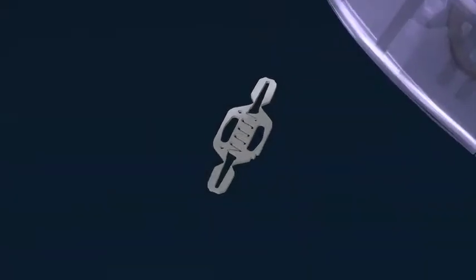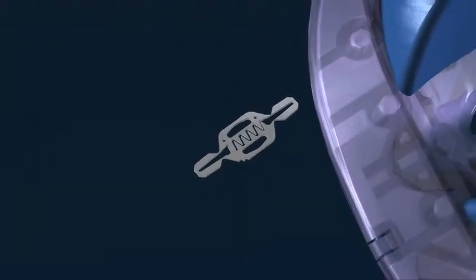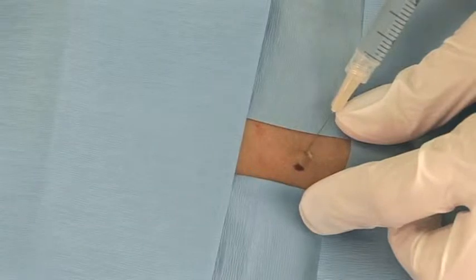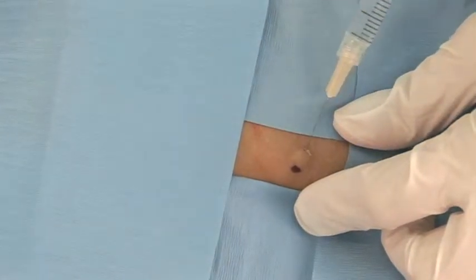The skin clip engages and the surgical blade cuts across the lesion to complete the quick procedure, and the wound is closed and secured. First, the lesion site is anesthetized with an injection of local anesthetic.